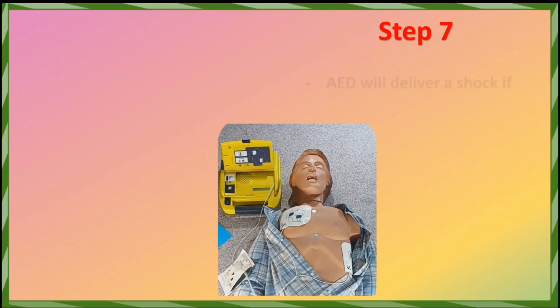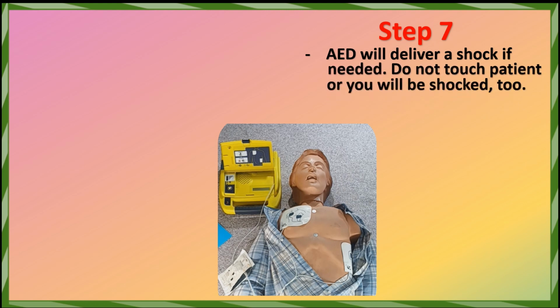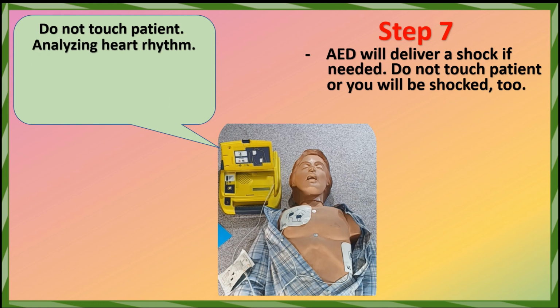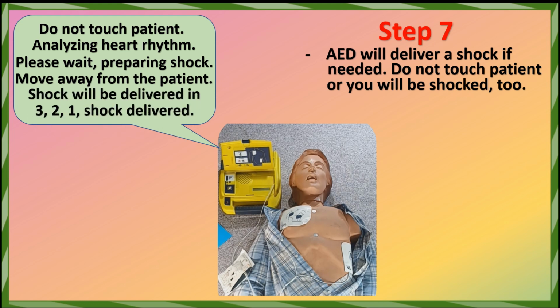Step 7. The AED will deliver a shock if needed. Do not touch the patient or you will be shocked too. Do not touch patient. Analyzing heart rhythm. Please wait. Preparing shock. Move away from the patient. Shock will be delivered in 3, 2, 1. Shock delivered.